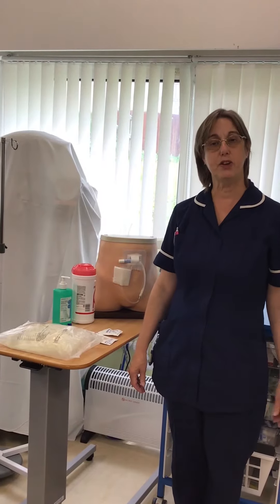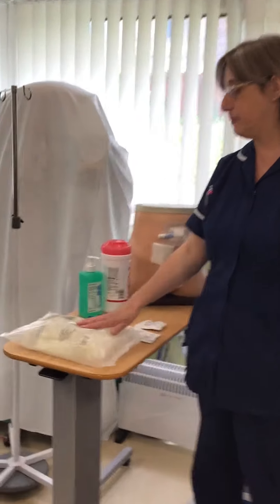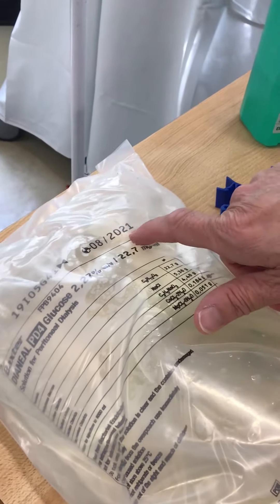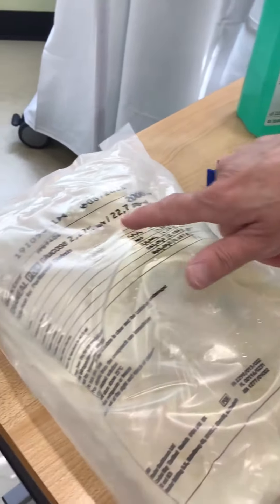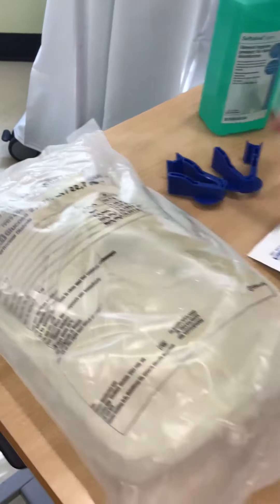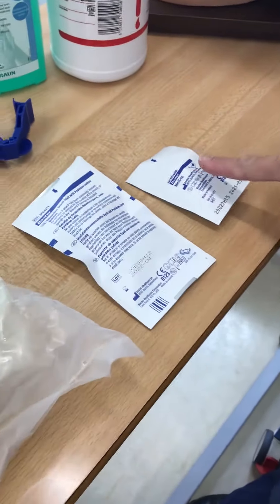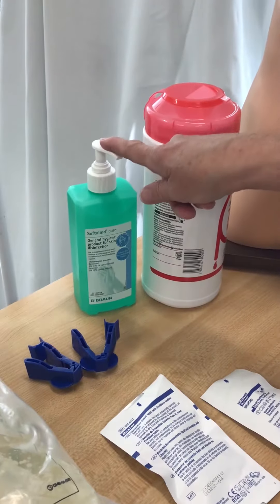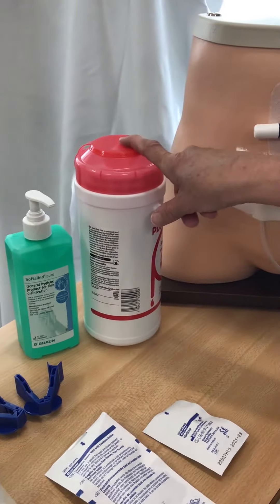First, you need to gather your supplies: a dialysis bag — you should always check the expiry date, this is August 2021 — the strength of the fluid and the volume. You need your shield, a cap, two blue clamps, alcohol hand rub, and a surface cleaner.